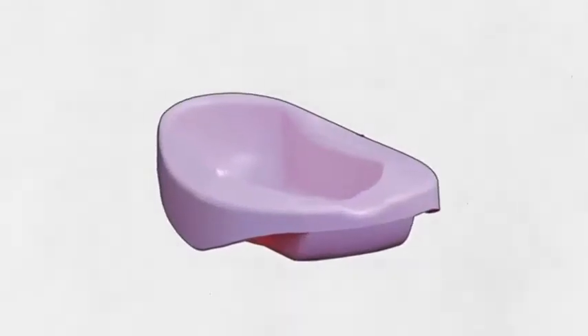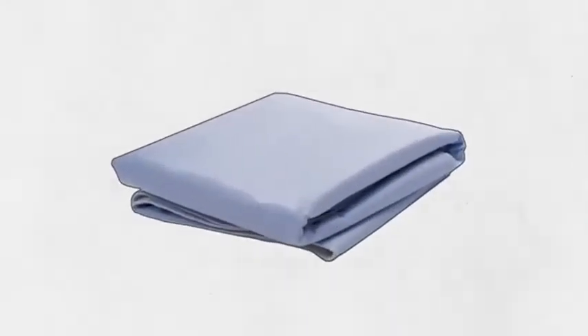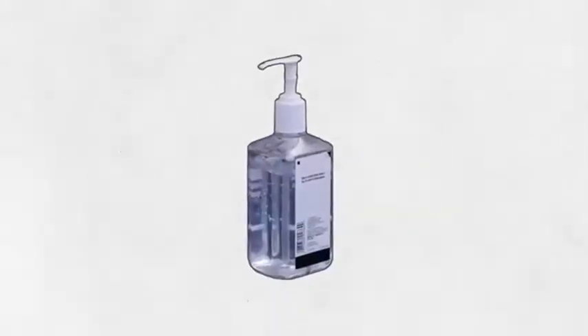You'll need to grab a bed pan, some toilet paper or wet wipes. You'll also need a waterproof bed pad and any skin care products they're using. Don't forget disposable gloves and hand sanitizer for good hygiene.